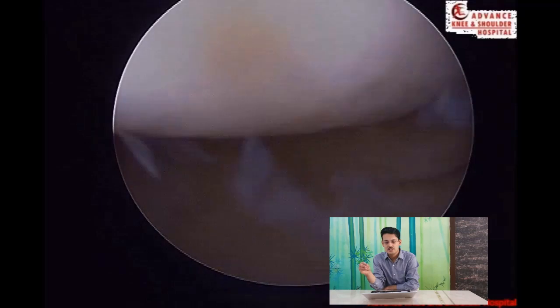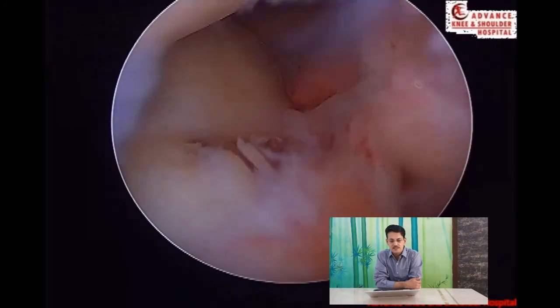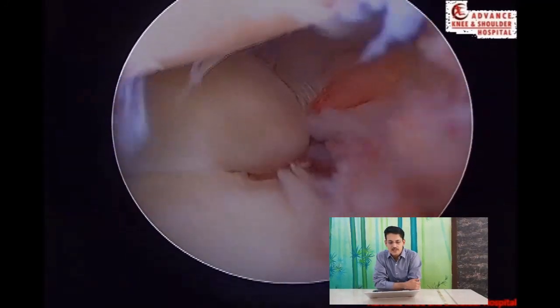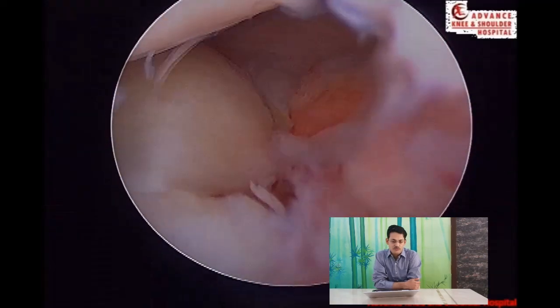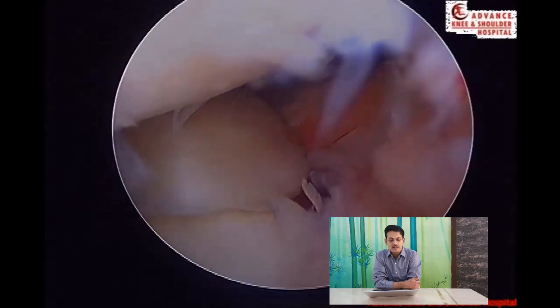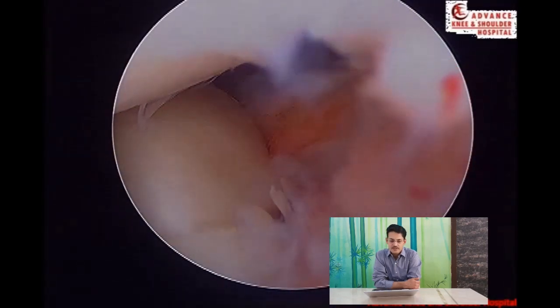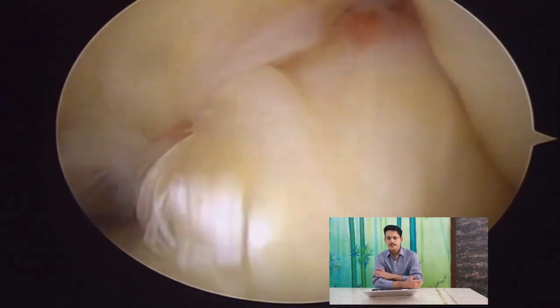The suture lasso is a very good instrument that passes the tapes nicely and holds them in place. Once passage is done, the root is attached to its original insertion. After passage, there is a very nice root repair, with the root attached to the original native footprint. This will actually prevent further progression of arthritis.